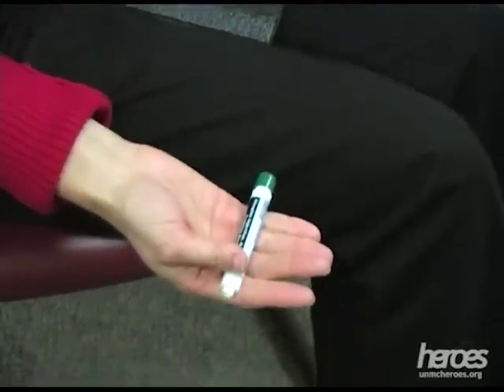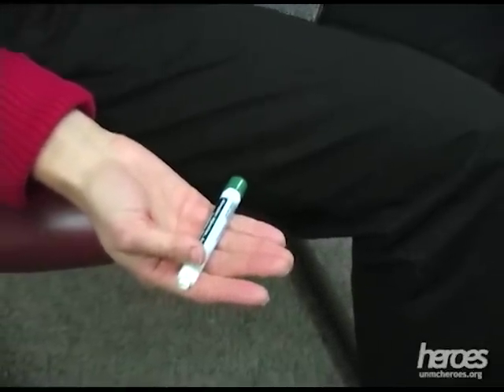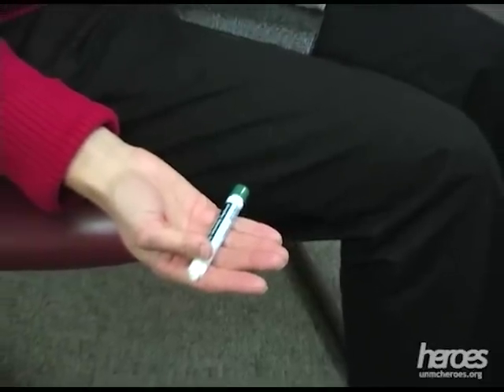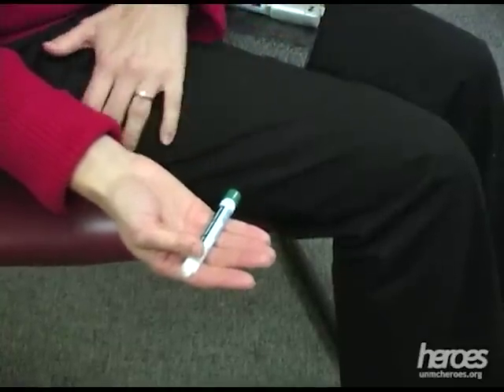Press the green tip at a 90 degree angle into the outer thigh. The device will activate when enough pressure is exerted and the needle will extend. It is appropriate to inject through clothing, ensuring that there is nothing in the pocket that might block the injection.